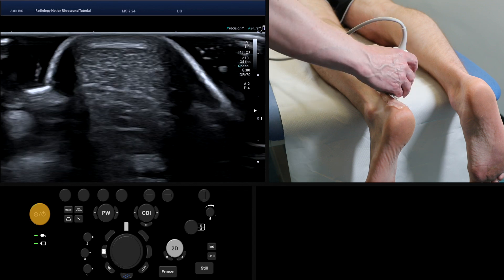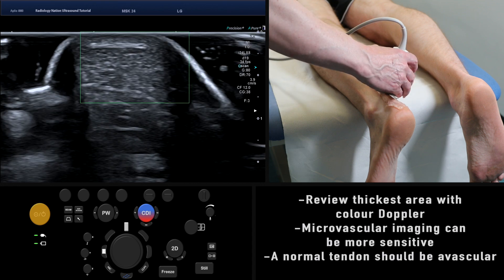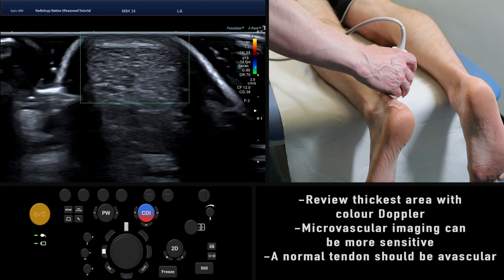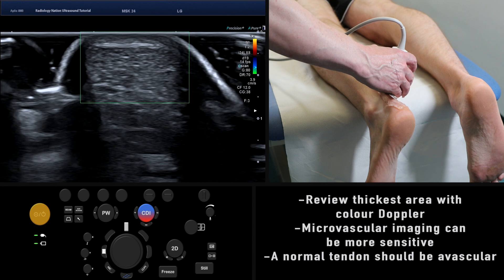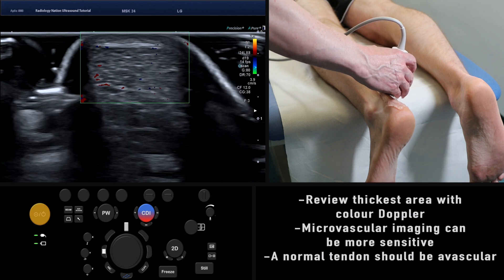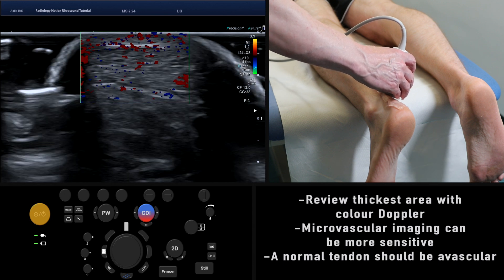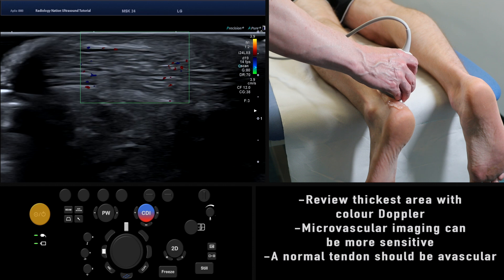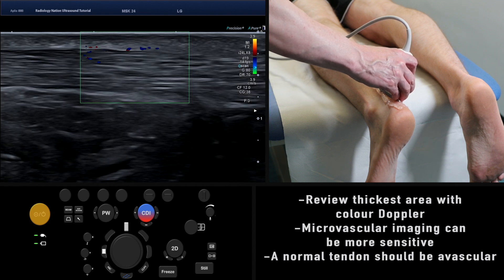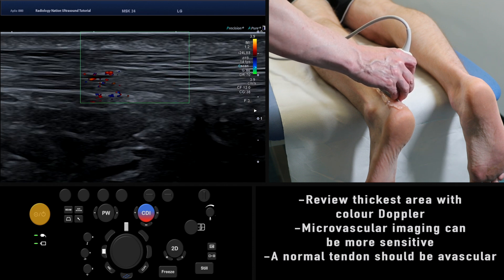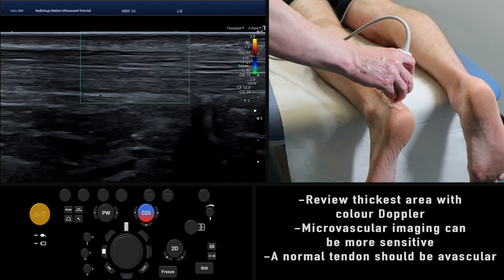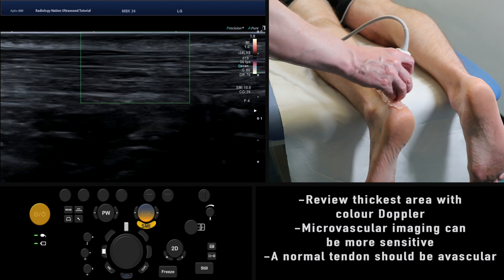At the point where the Achilles tendon is at its greatest thickness, in either longitudinal or axial section, enable Colour Doppler to ensure that no flow is detected internally. Internal blood flow may suggest neovascularization, which occurs as a result of tendinopathy.